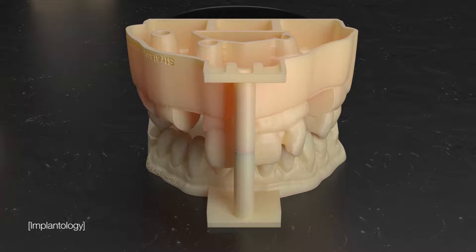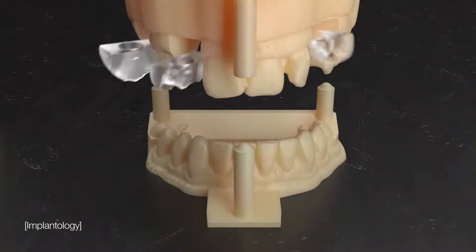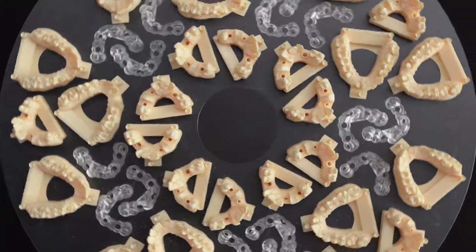The Dentajet is like having three printers in one. Print opaque and rigid implant models, soft gingiva masks, and biocompatible surgical guides, all in one tray in large capacities in a single, unattended job.